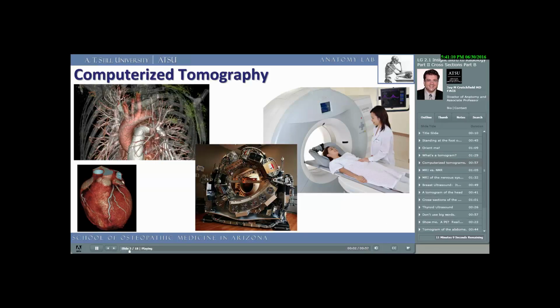Here's a picture of a CT scanner. The patient is lying at a fixed focal point. As the patient moves through the scanner, the focal point changes, and it allows for the CT scanner to refocus on each body organ at each new focal point.